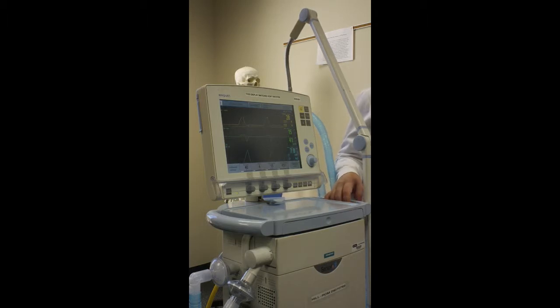I know from some of you, you've already seen that that's not always the case. The RTs will go, yeah, there's a mask. And the student will go, no, there's not. So, very important. Also, just as a side note, if you go on a transport, you never, ever, ever go without a mask. Don't ever think a patient can't get extubated en route to somewhere, because it's actually fairly easy. And the last thing you want to do is be transporting somewhere to somewhere and then get extubated and you not have a mask. I can promise you will be in your director's office. And hopefully that patient won't die. So that's very serious. I've been with patients that extubated themselves en route to somewhere.